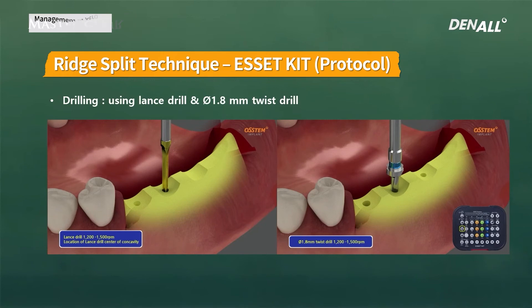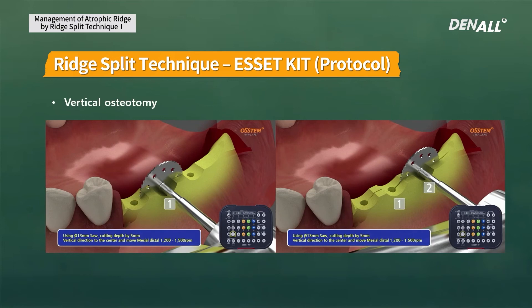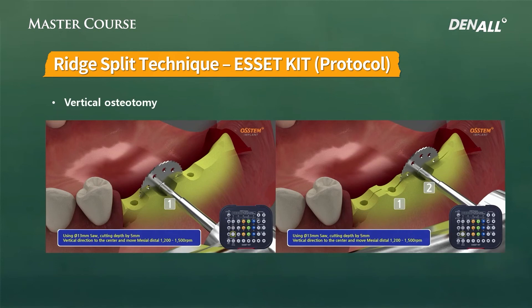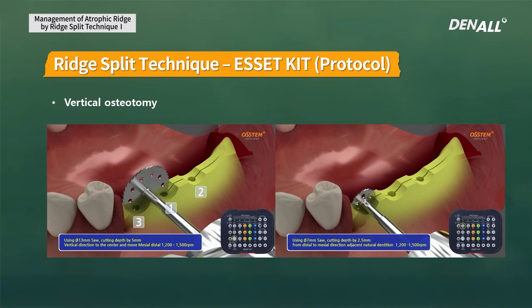Steps 1 and 2 in the protocol can be switched — osteotomy can be done first and then initial drilling. In the standard protocol, initial drilling is done on implant placement sites first, and horizontal osteotomy is formed by connecting these drill holes. In a three-tooth missing case, osteotomy is started in the center area and then moves to the distal area.